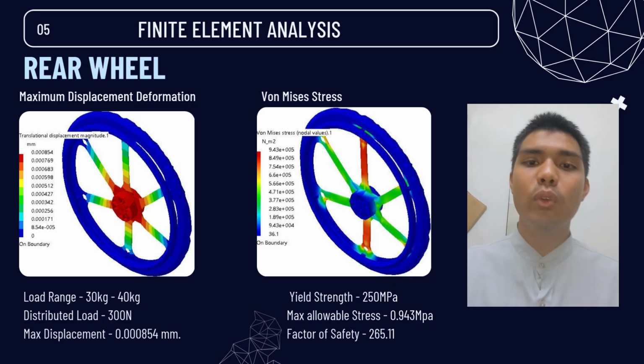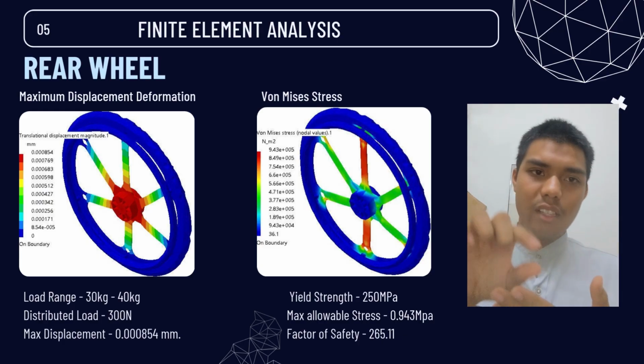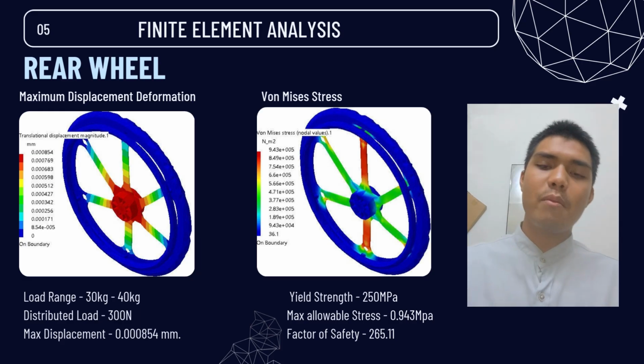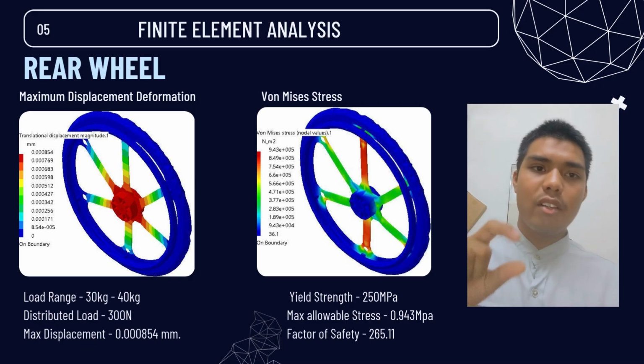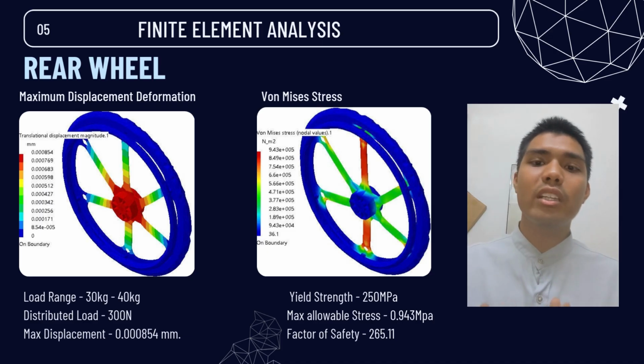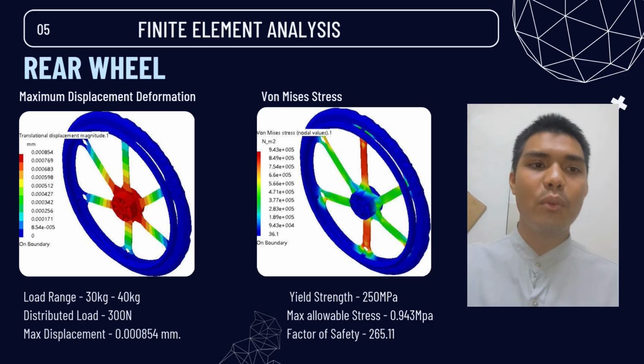Now we continue with the rear wheel part. We can see that we apply the load on the hub of the rear wheels, which is the center of the rims. This is because that part is connected to the wheelchair frame and has the load applied when people sit on it. So we choose the center because there is a shaft connected to the frame. So we apply only 300 newtons. We divide the load by 2 because the wheelchair has two wheels, so each wheel has 300 newtons applied.